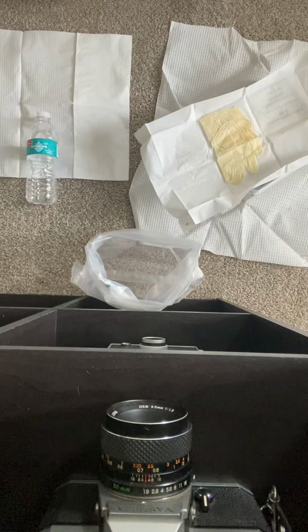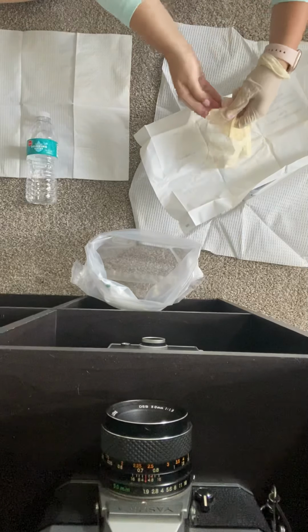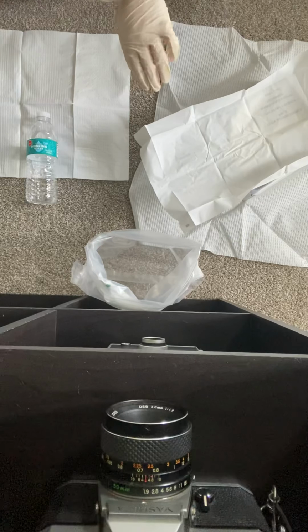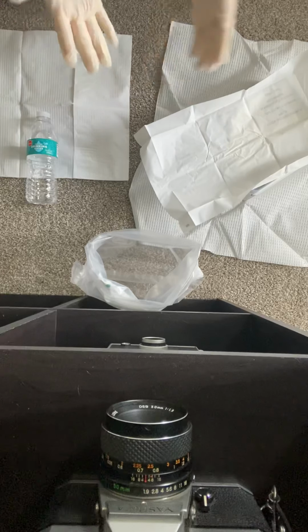Obviously I would do my hand hygiene before I put these gloves on. Okay, and then I'm going to put this over my watch here. Sorry, I should make sure that you can see that. Okay, so now my hands are sterile.